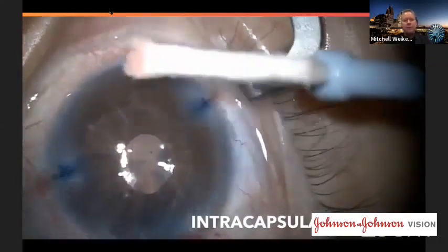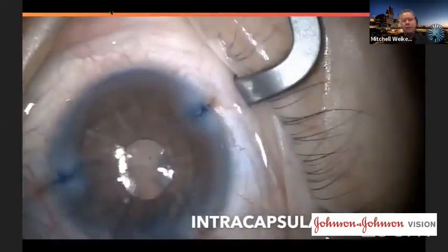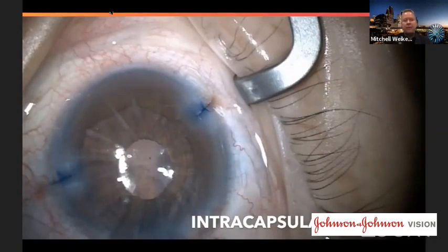As you can see there, this patient has some ability to constrict his pupil. So I injected a little Miostat at the end to constrict the pupil because I want to make sure that there aren't certain sectors that might constrict more and actually cross over into the aperture of the implant itself. And I did a few little sphincterotomies there to prevent the iris from constricting a little too much.